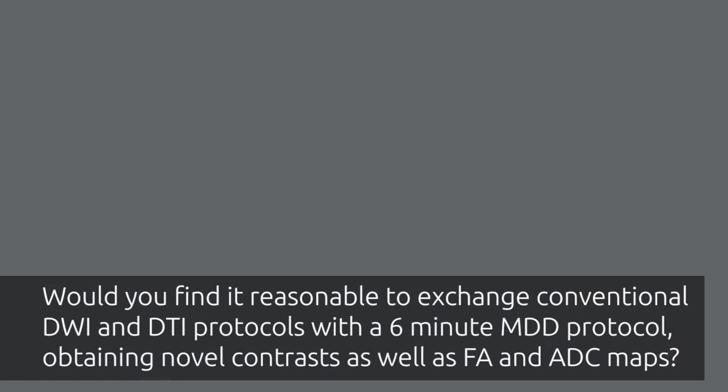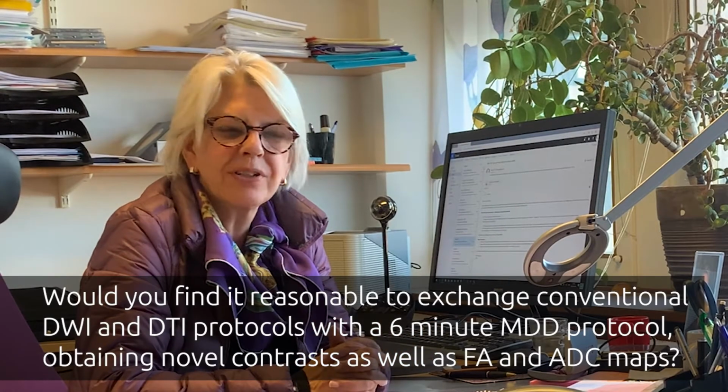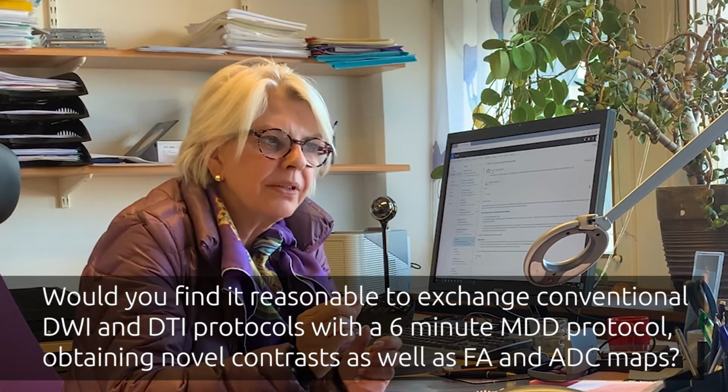Would you find it reasonable to exchange the standard DWI and DTI protocols with the 6-minute MDD protocol for obtaining all conventional maps as well as all the novel MDD maps? Take a whole MR study, 6 minutes is a short period and it's well worth it. And also now, if we can do it already in 3 minutes, that might be even better for the clinical practice. And I think clinical colleagues will in the future appreciate it as well.